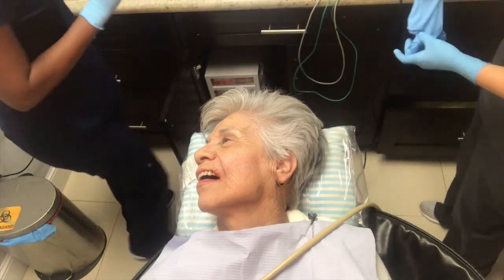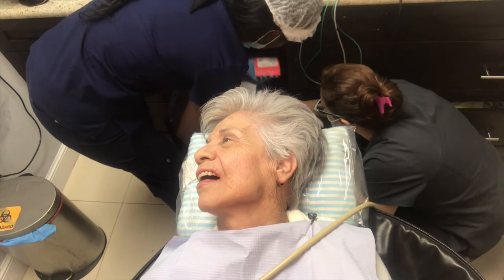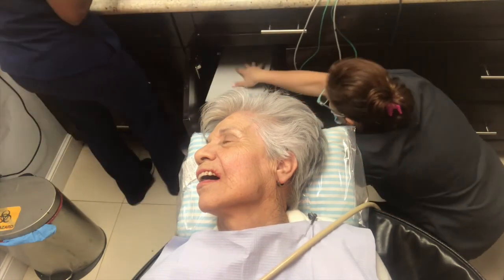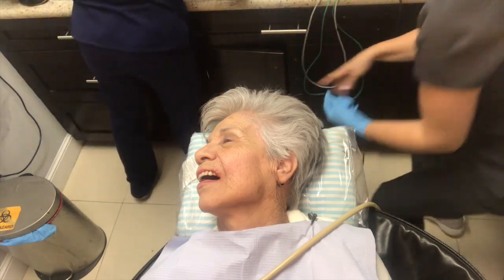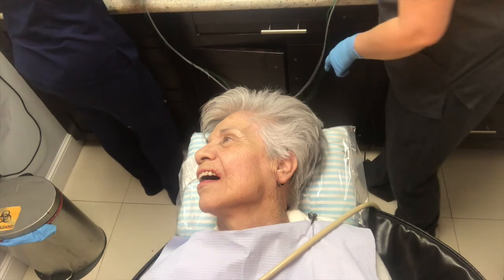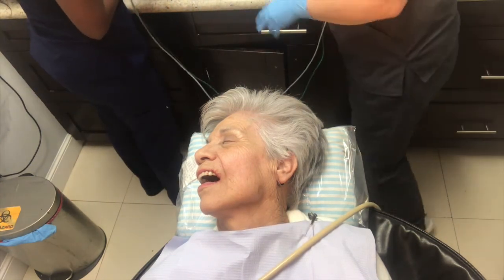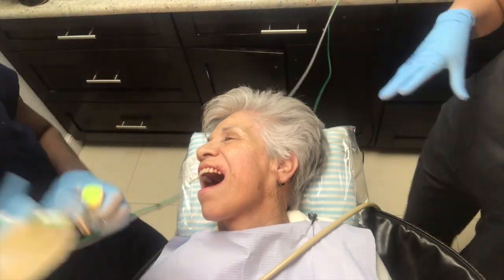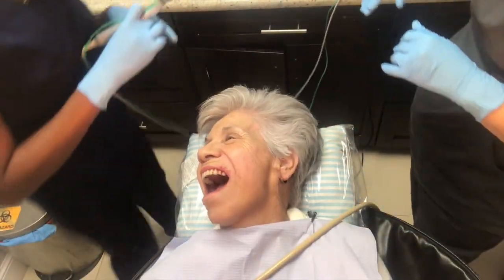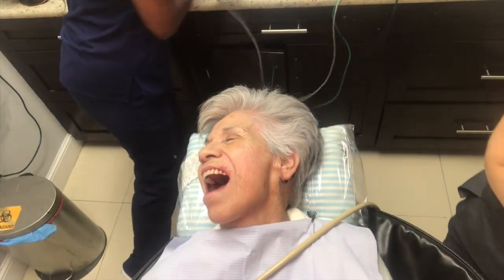So if you can see, I'm going down underneath my cabinet, and that is where I keep my implants. If you could see in that red box, and the camera can't go up to show you what's on the counter, inside of a sterilized box in plastic, sealed a couple times like Fort Knox, my assistants like to joke, is the implant. And you can see me opening it up. It has a green cap on it. And I try to take it out at the last minute right before I'm about to place the implant.